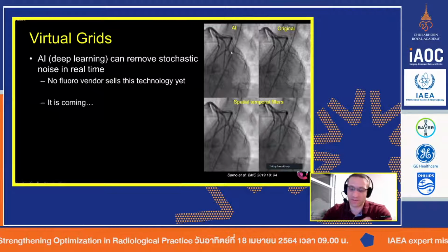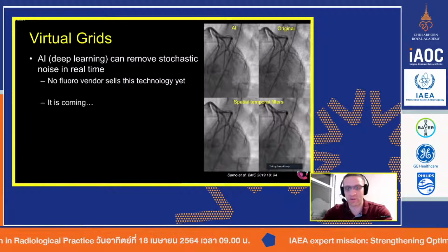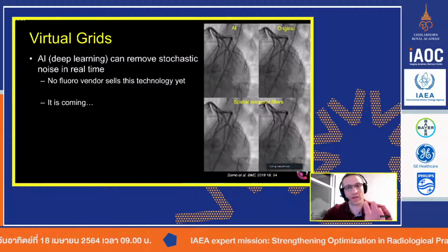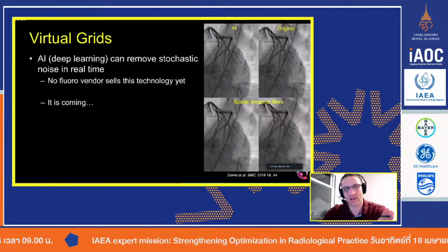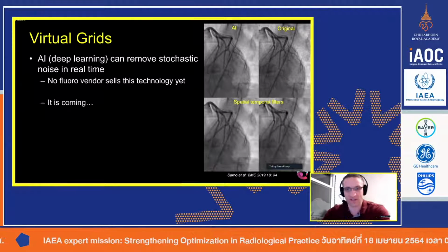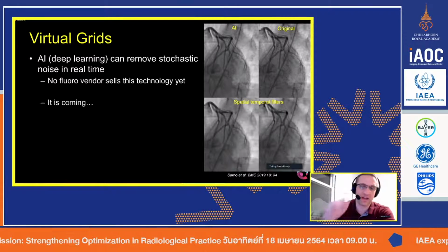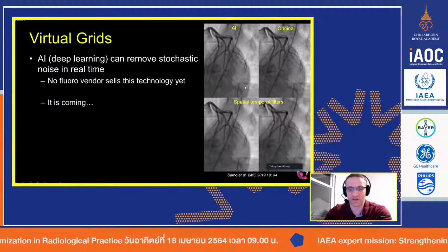Interestingly enough, and I'm not really going to go down this rabbit hole, we've been doing a lot of research in this area, and where we thought there were a lot of really interesting applications to AI, we're starting to realize that there are some limitations. Imaging anatomy, every day AI makes the image quality look better because it just removes the noise from a stationary structure.